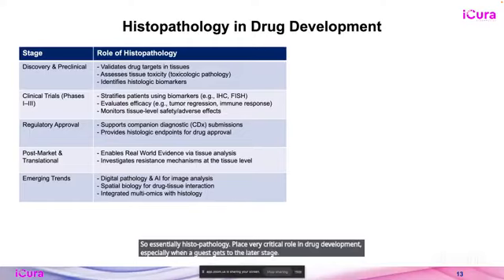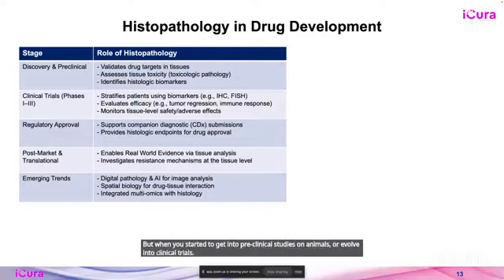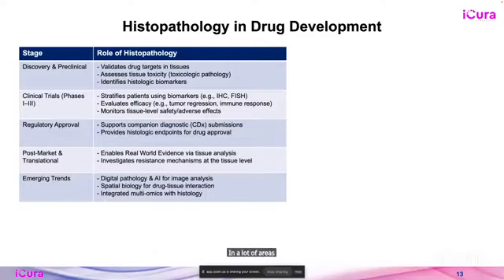Of course, probably not the compound screening and those kinds of things. But when you start to get into preclinical studies on animals or evolve into clinical trials, in a lot of areas, histopathology plays a very important role, as shown here in the table, right?